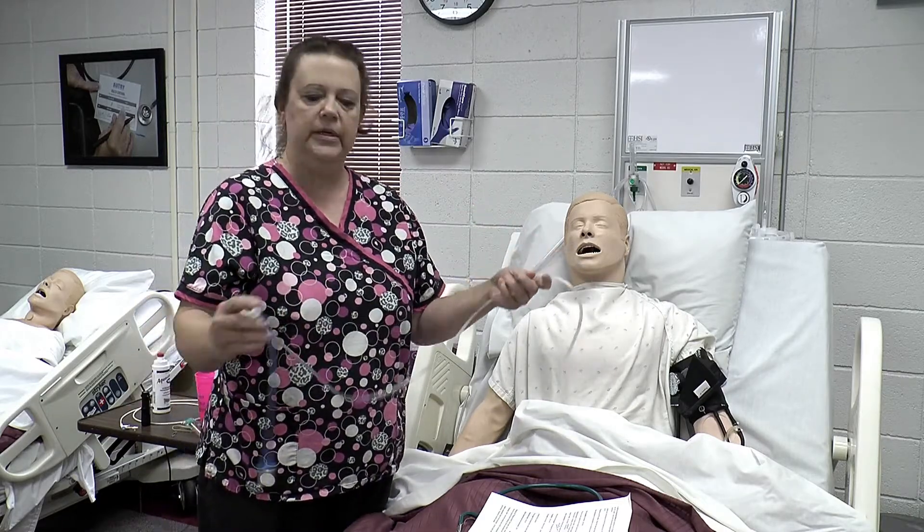Does he have an allergy? Check his armband — does he have an allergy to tape or adhesive? Because we don't want to put adhesive tape on his nose if he has an allergy to it. And of course, we will explain the procedure.